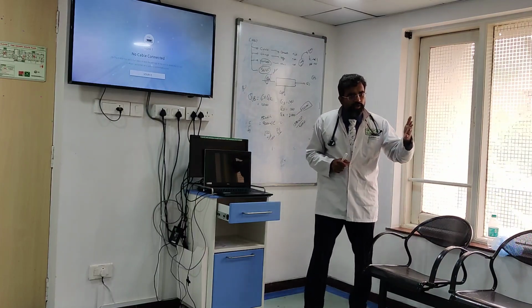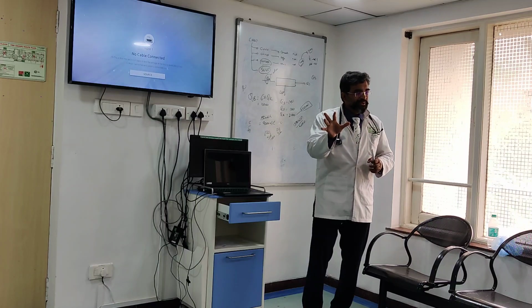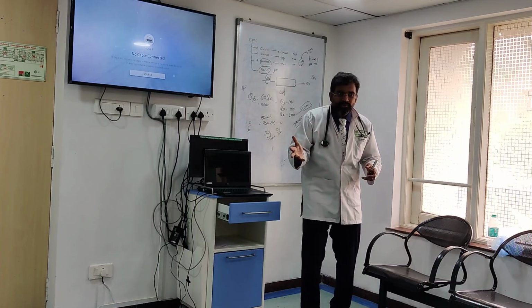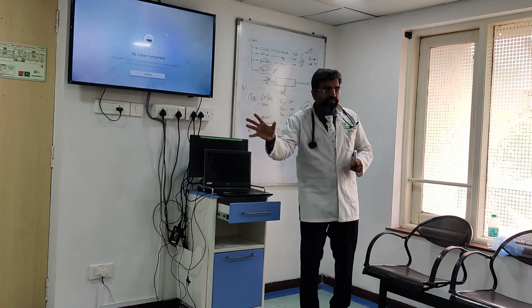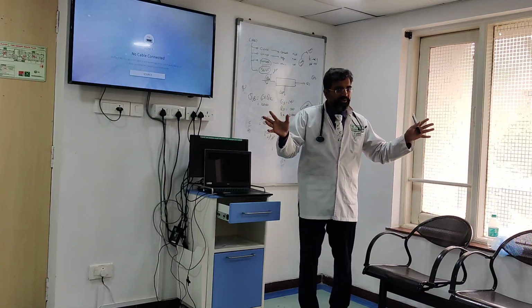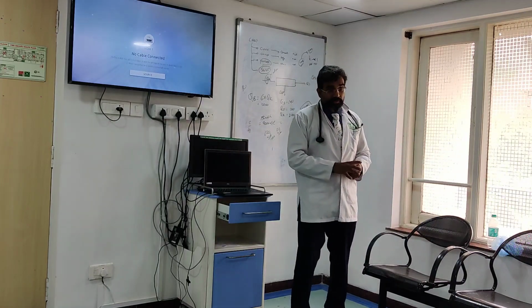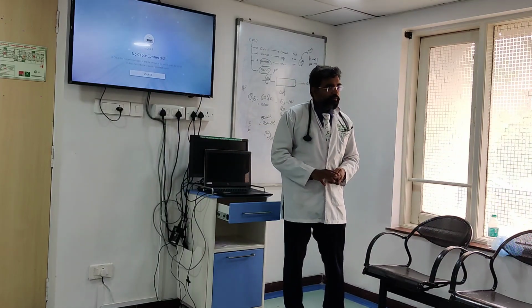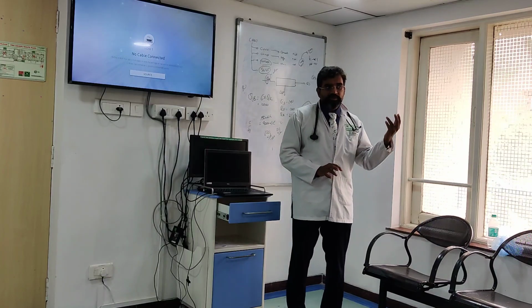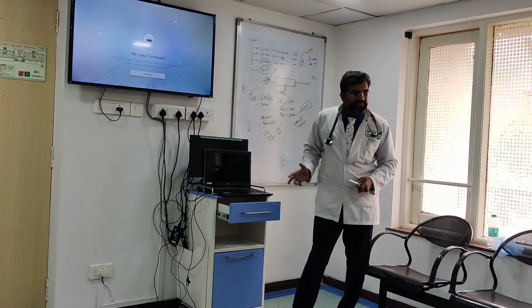So in myoglobinuria, sometimes you may want 2 CRRT machines. You require 2 CRRT machines because you just can't go too high. So you have 1 CRRT on this side, 1 CRRT on this side, both do the same thing. Are you understanding? When you have very severe rhabdomyolysis, for example snake bite, you have very high myoglobins. You may actually require 2 CRRT machines because you just can't optimize otherwise.